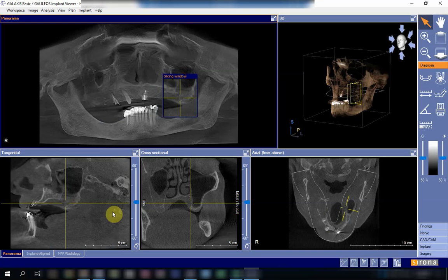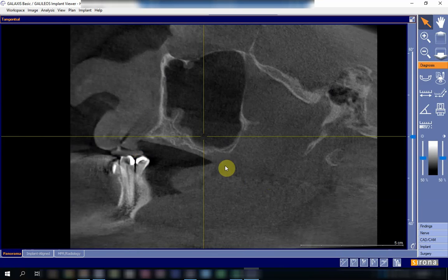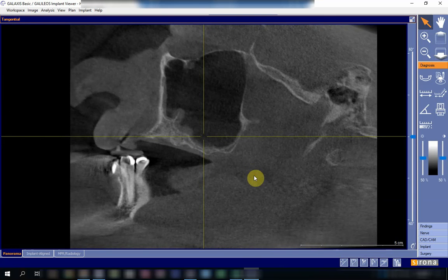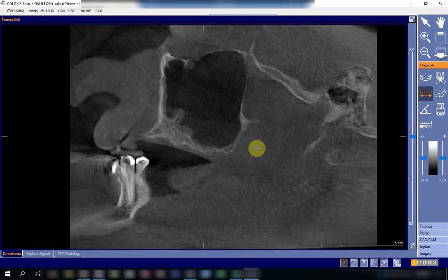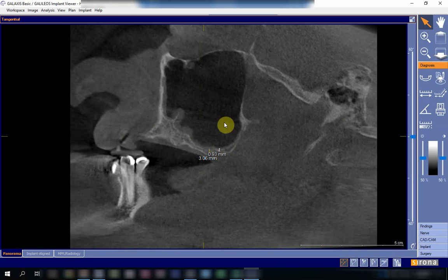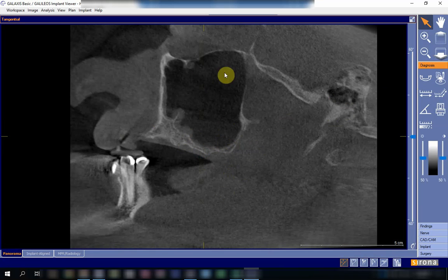Looking at the other side where no extraction occurred, in the sagittal view the level of bone is almost negligible — we can hardly measure a distance of three millimeters at the widest area at the molar. If we go to the second molar, there is only around one millimeter of bone. Of course, if there is any retained root in this area and an attempt to remove it, you would expect a communication between the maxillary sinus and the oral cavity.